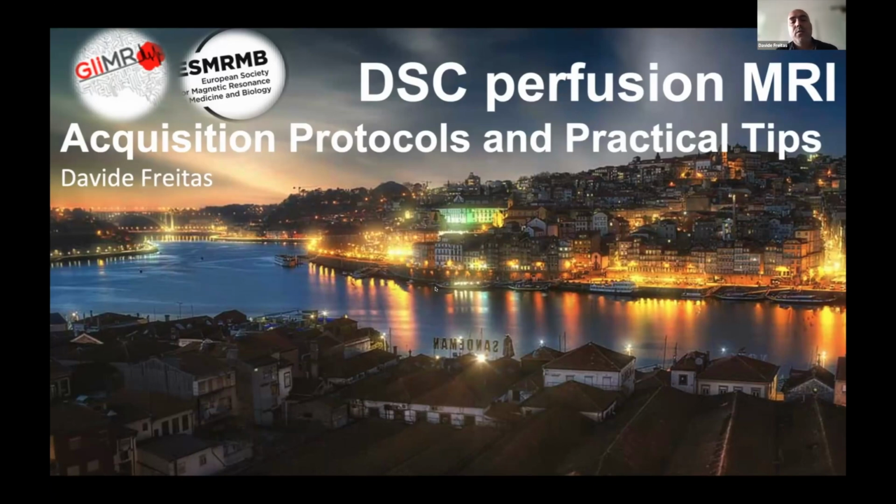In our practice, we have a strategy that uses the preload, the pre-bolus, because our main application of this technique is for gliomas, and we are trying to maintain the same strategy so that we can compare between cases, and we have a stable strategy for all the cases. At the same time, we use both strategies.